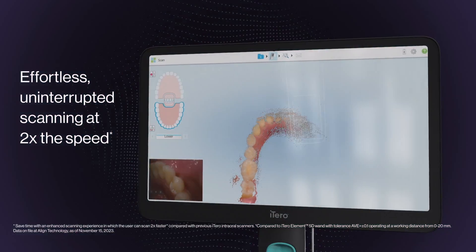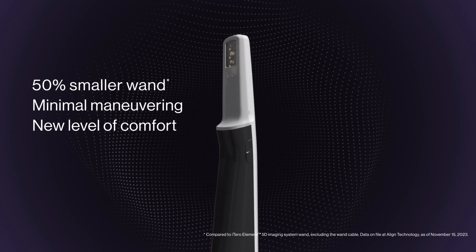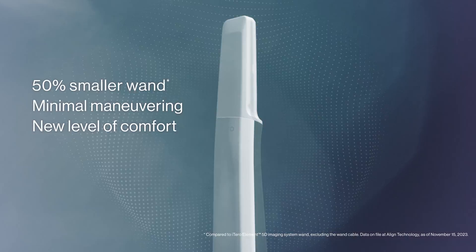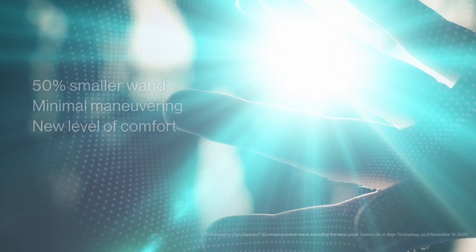Imagine fast, effortless scanning and a smaller design that lets you scan with minimal maneuvering, setting a new level of ergonomics and comfort for you and your patients.